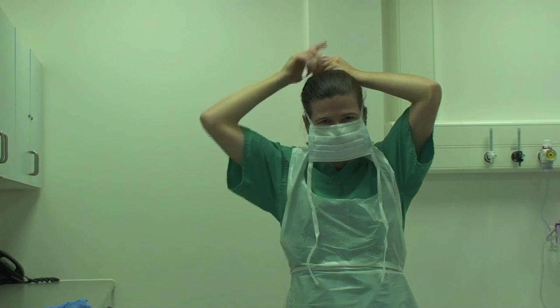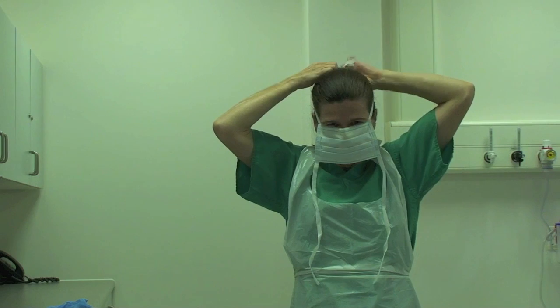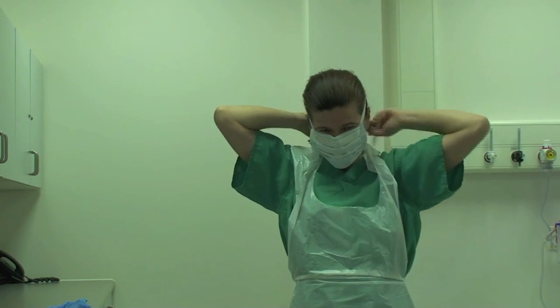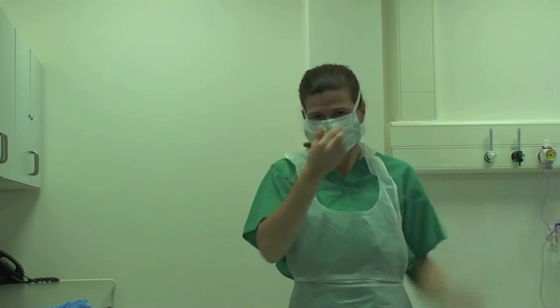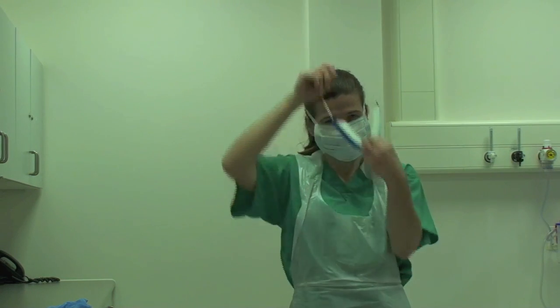If there is a risk of splashing with blood and body fluids then a fluid repellent surgical mask should be worn. It is important to mould this to the face, ensuring you pinch at the nose to ensure a good seal. This would be followed by a visor.